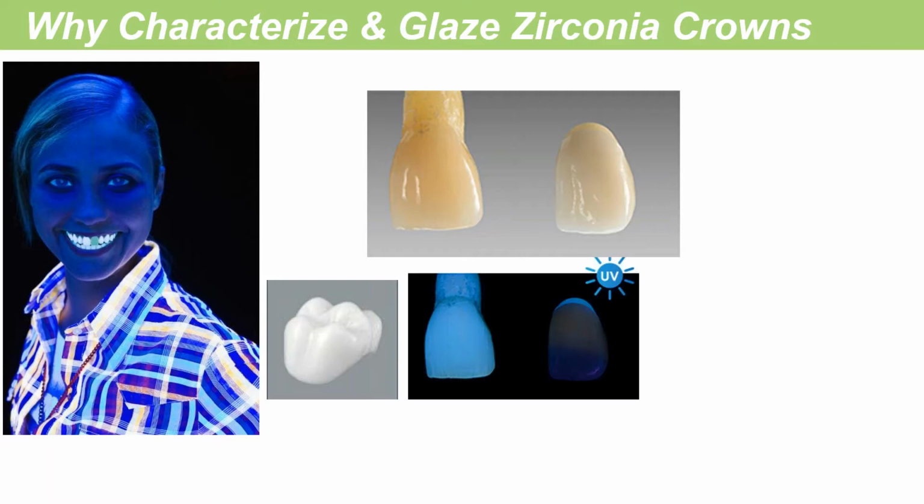In addition to that, zirconia has that problem to begin with, that it is very dead looking. And it's because zirconia is very hard, it's very dense. And where do we get our color and our vibrancy and that kind of stuff? It's through light transmission.